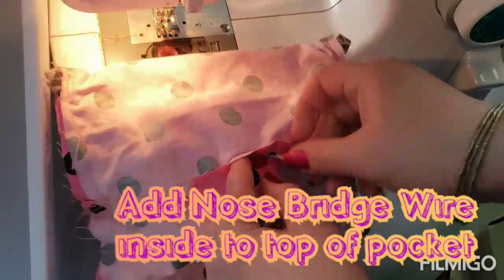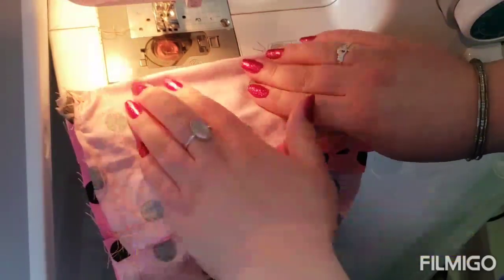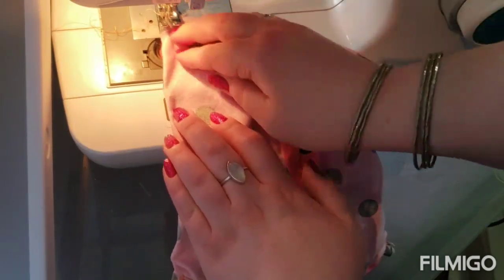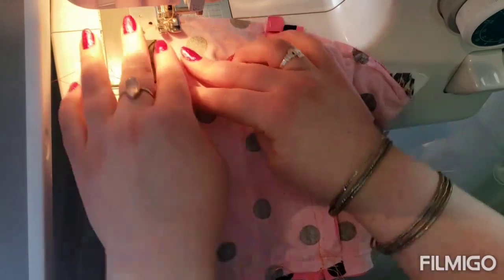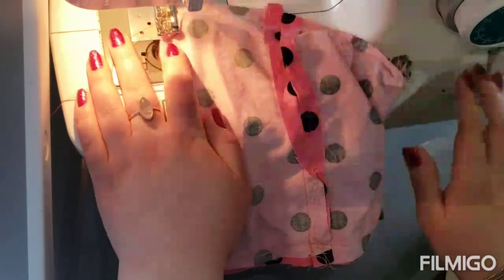Now I'm going to show you how to put in the nose bridge. Take the wire and put it on the inside of your pocket after you've sewn both sides, and press it up to one side or the other. My wire is right here. Now I'm going to go from this side and just sew a thin little strip right in there to hold the wire in place. Work through carefully near the elastic. Don't forget your backstitch.